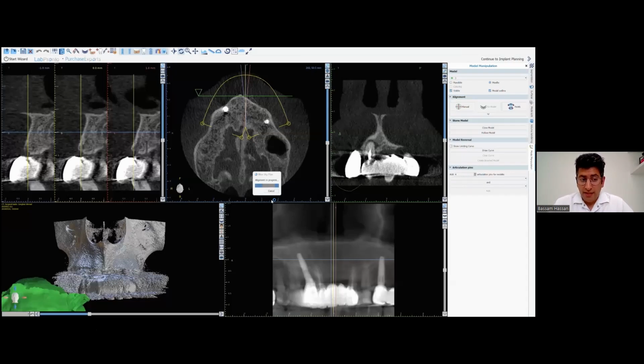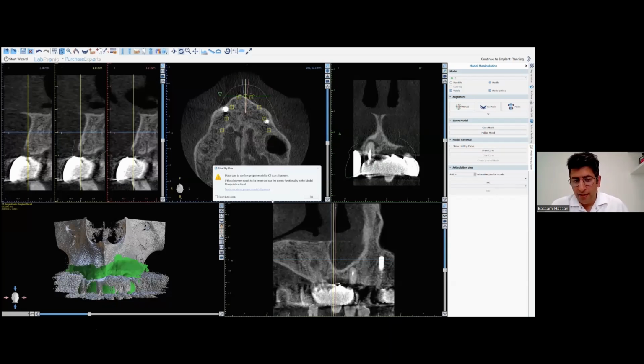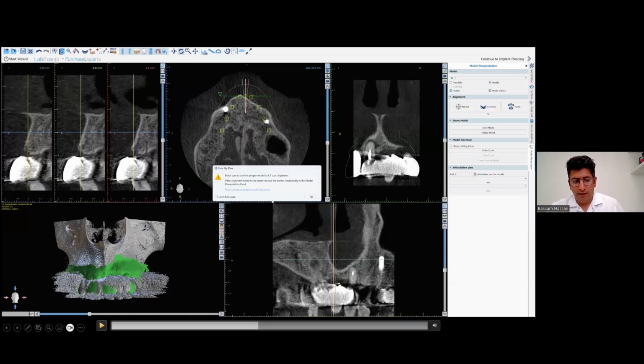But it makes sense, because you have an image which is very unsharp for you as a human, because you are using default segmentation. Just look at how beautifully outlined the restoration is on the cone beam. Look at this fantastic outline. This is no problem for an AI algorithm doing machine learning. Machine learning will detect an outline, and if you can see it as a tooth, the AI will see it as a tooth as well.